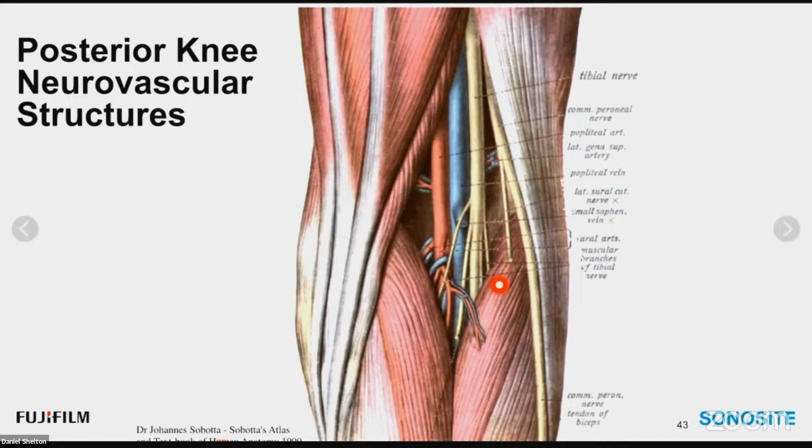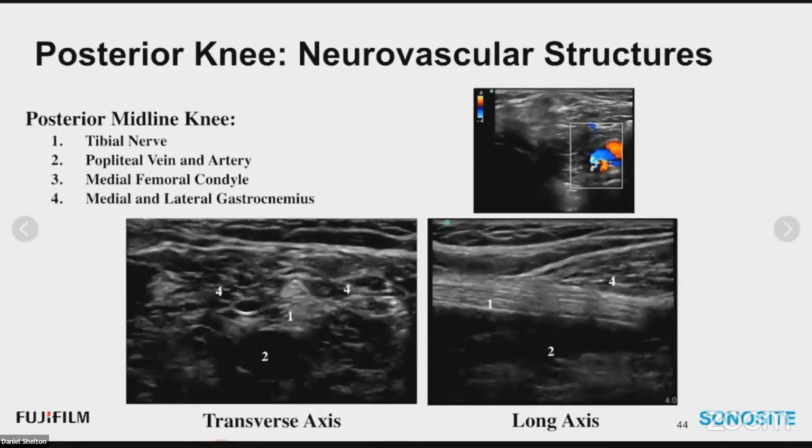Many divisions can come off in the form of these little sural branches, which can be appreciated with ultrasound. But mainly, I want to go over the scanning tips and tricks to finding this common peroneal nerve and making sure that you are able to identify that bifurcation and what to do when a normal nerve doesn't look normal anymore. So what is a normal nerve?